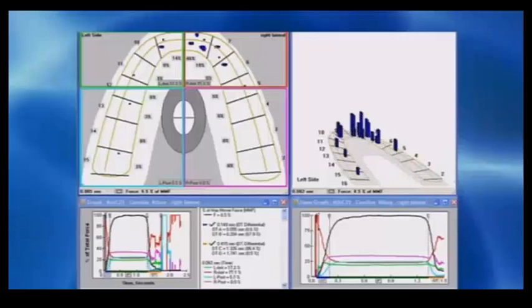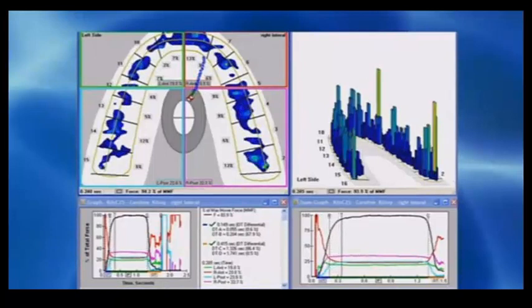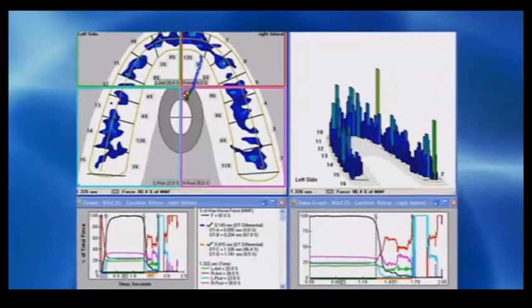So, Caroline, in looking at the data after a week, there's been the development of some anterior pressure. You can see that here, that your front teeth are becoming more forceful before the back teeth start to get into contact. So I'm going to need to relieve that. However, your center of force is still very stable. It hugs the midline, comes straight back to the middle of your occlusion, and that's a really good sign for positive closure and balance in your bite. So the front teeth I have to lessen a shade. The COF, the center of force, starts a little too far forward and moves outward and then moves backwards, and that indicates anterior pressure.